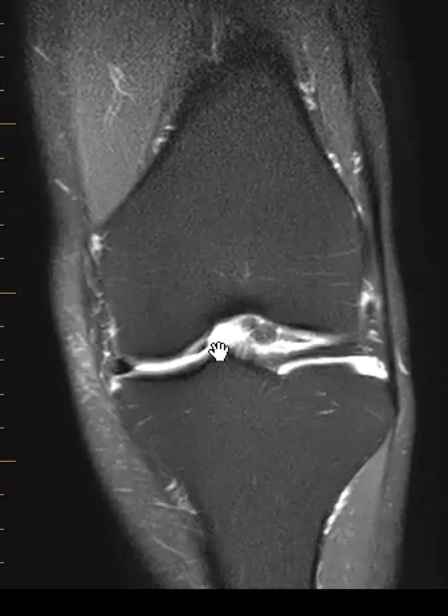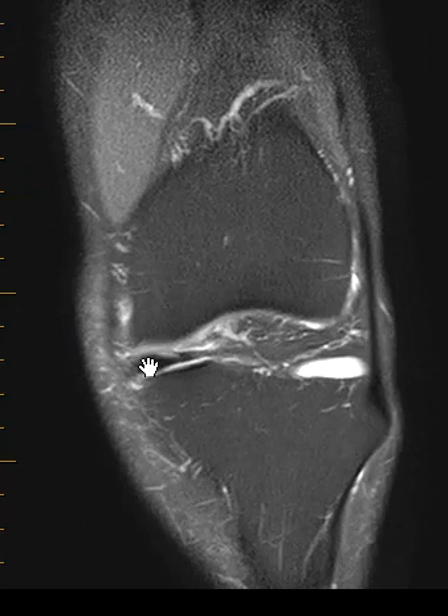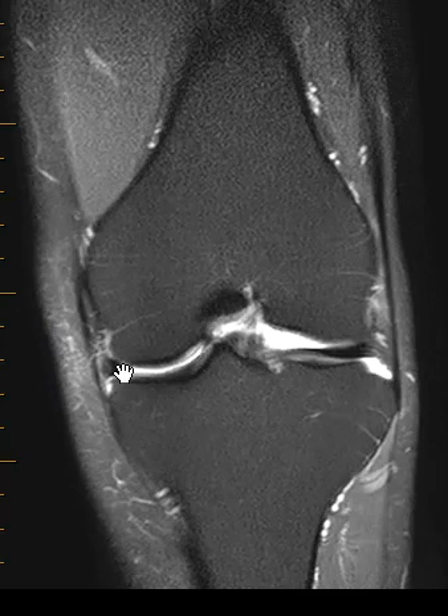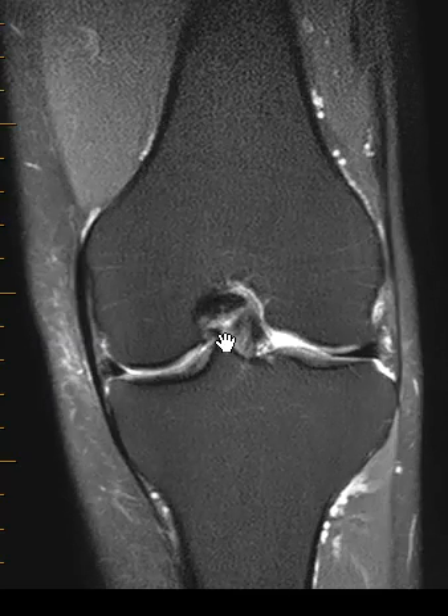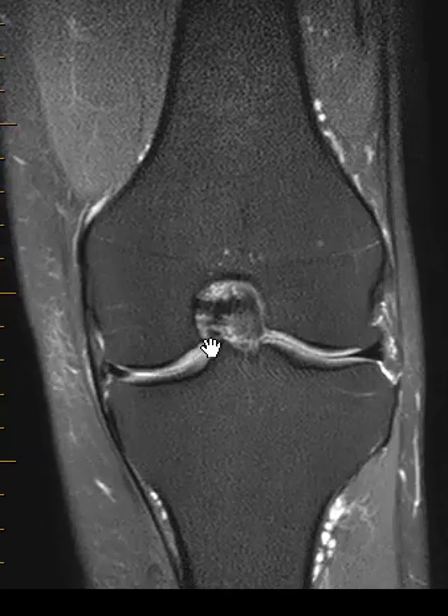So the meniscus fragment is torn and it's flipped inwards. If we go towards the front, we can see that little piece right there — that little horizontal black line, it's continuous. It's still attached here in the front, and then a little piece flipped off into the middle, and then it comes back, and if we go to the very back it's continuous with the back.